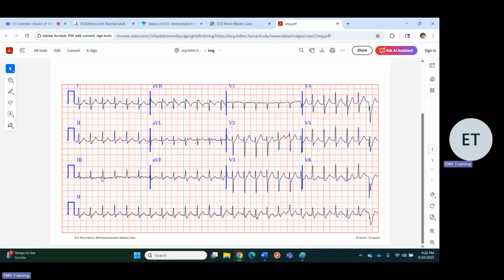I mean, I don't know, the classic they talk about in school is Wolff-Parkinson-White. It just seems like there's something going on, like it's one way or another. It's very subtle. It's atrial-ish, not sinus. And the axis and the R-wave transition are relatively normal, slightly abnormal, but without any clinical context, previous EKGs, patient age, or cardiac history, it's very tough to know for sure. Like, this might just be the patient's baseline. And the structural heart abnormalities may be like years of heart failure and cardiac disease.